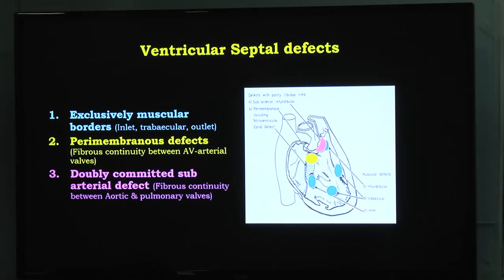If you're doing any intervention, it should be as good as or better than the previous procedure. Otherwise, you shouldn't do it. And even the ASD, when I do it, I tell a lot of people, if there is a safe surgical procedure, if you think that is very high risk, don't do it unless the patient party really wants you to do it.